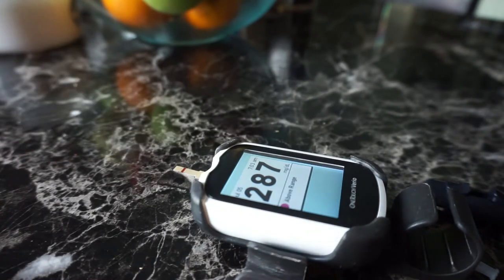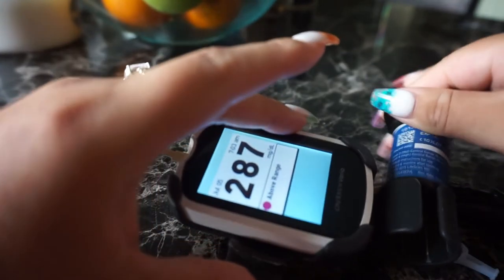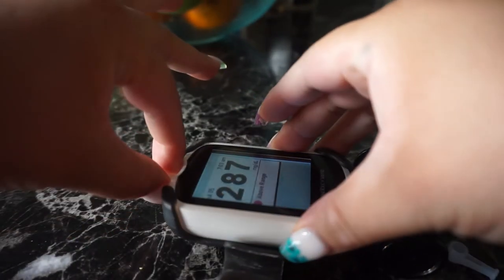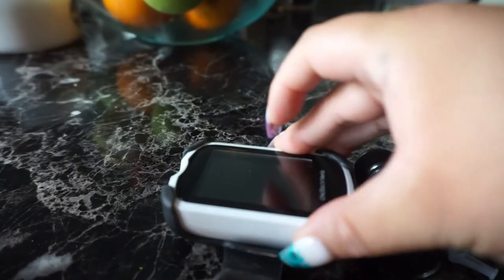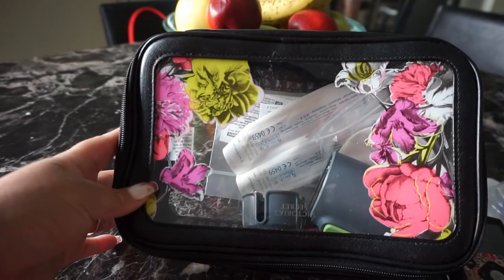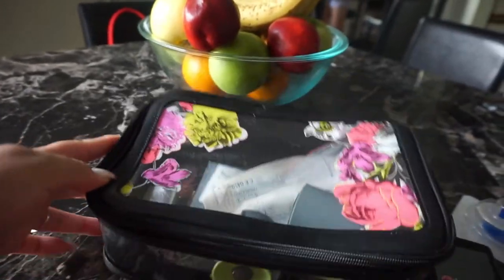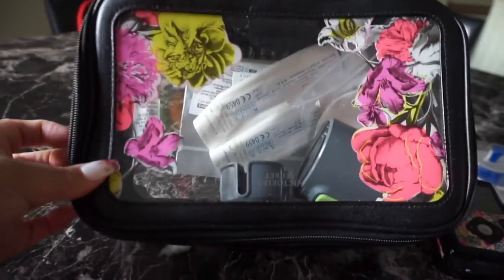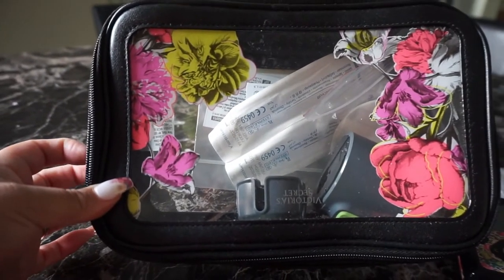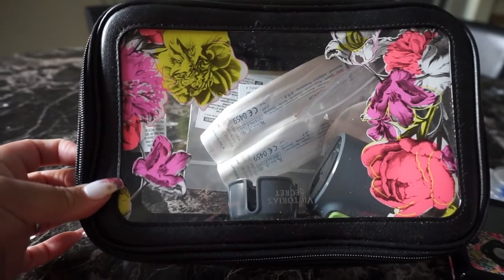It's gonna read my sugar — 287. That is kind of my norm at the moment. It's obviously not a normal blood sugar, but I'm still working on bringing it down from what it used to be. So 287. I showed you guys this little bag before — this is where I keep all my diabetic supplies. I'm gonna show you how I apply the next thing. Once again, if you don't like needles, this is a part you may want to skip.